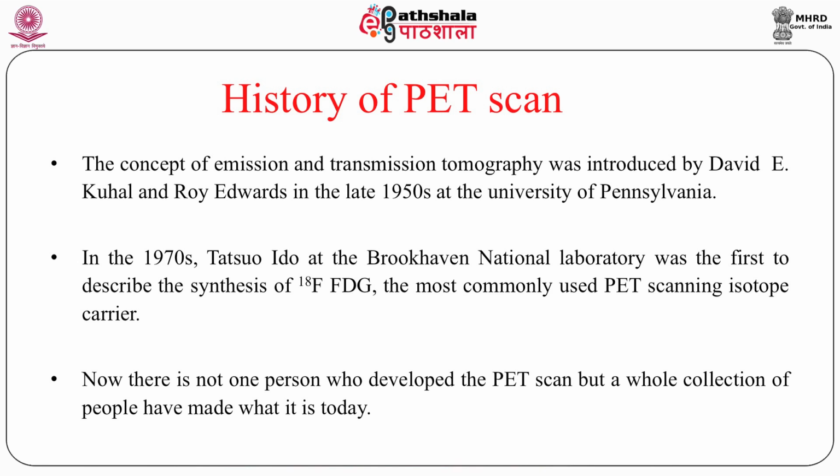So PET is basically positron emission tomography, but the transmission tomography concept of this technology was first given by David E. Kuhl. If you go back to the 1970s, Tatsuo Ido at Brookhaven National Laboratory was the first to describe the synthesis of fluorine-18 FDG, the most commonly used PET scanning isotope carrier.